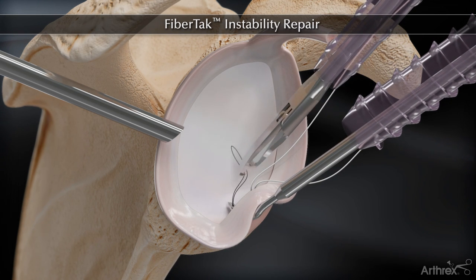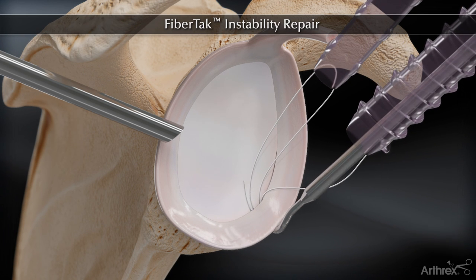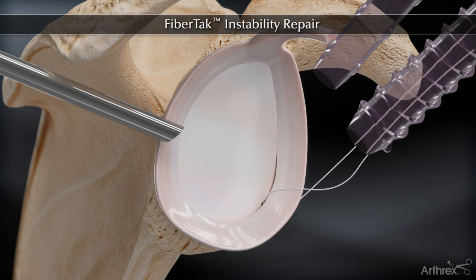The wire is retrieved and the suture is inserted into the loop. The wire and suture are retracted back to the lasso tip and then shuttled through the tissue.